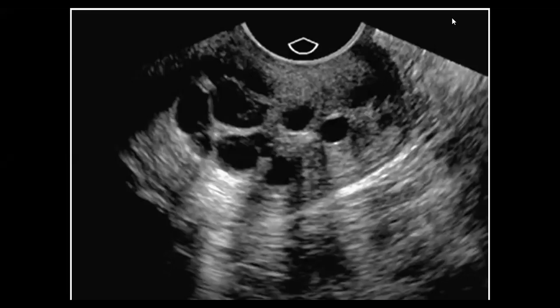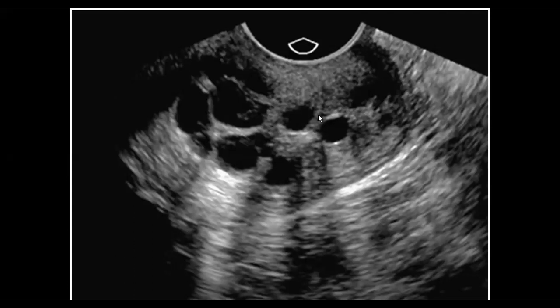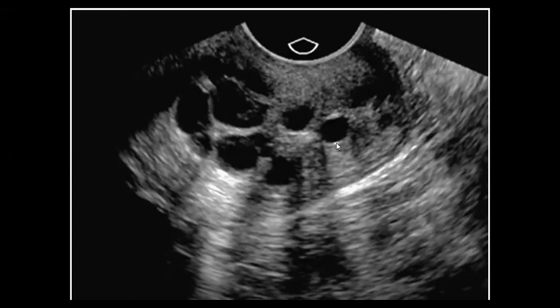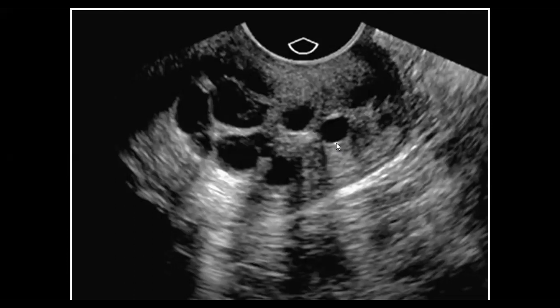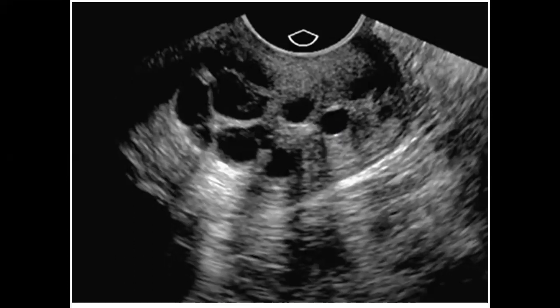Today we are speaking about ultrasonographic assessment of the cervix and cervical canal. A first and common finding is multiple small cysts with clear content — this is mostly Nabothian cysts. It is one of the manifestations of chronic inflammation of the cervix, or chronic cervicitis.